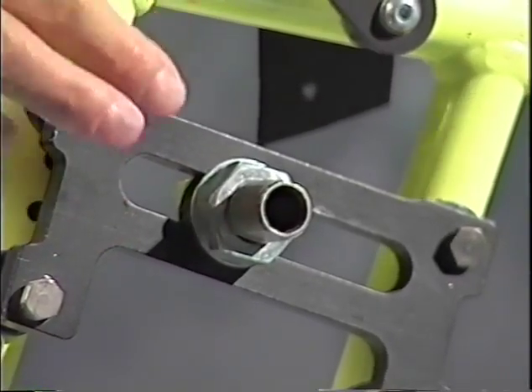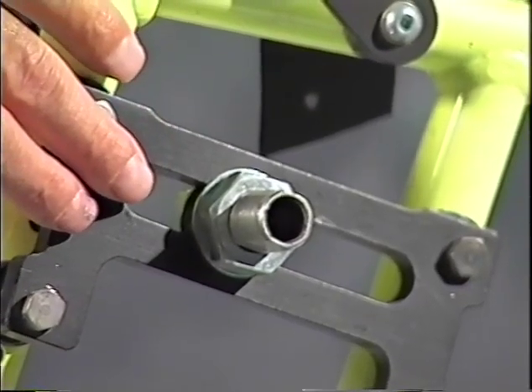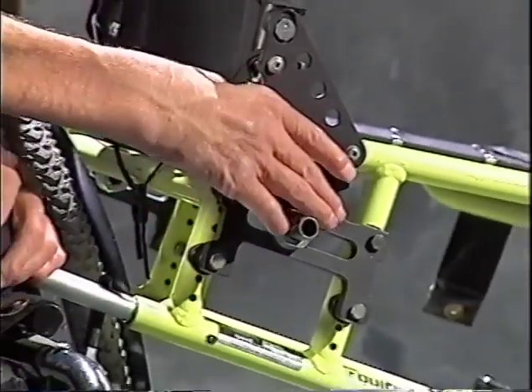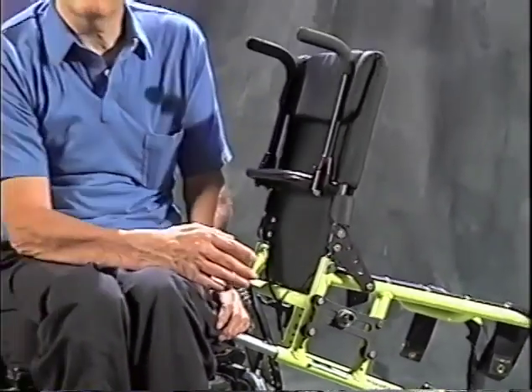I generally move it fairly far forwards, as far forward as is comfortable without pulling too many wheelies every time you go to take a push. And what you'll find is the better your balance is, the further forward you can get away with moving that wheel forward. But that also changes, in effect, the gear ratio of this wheelchair.